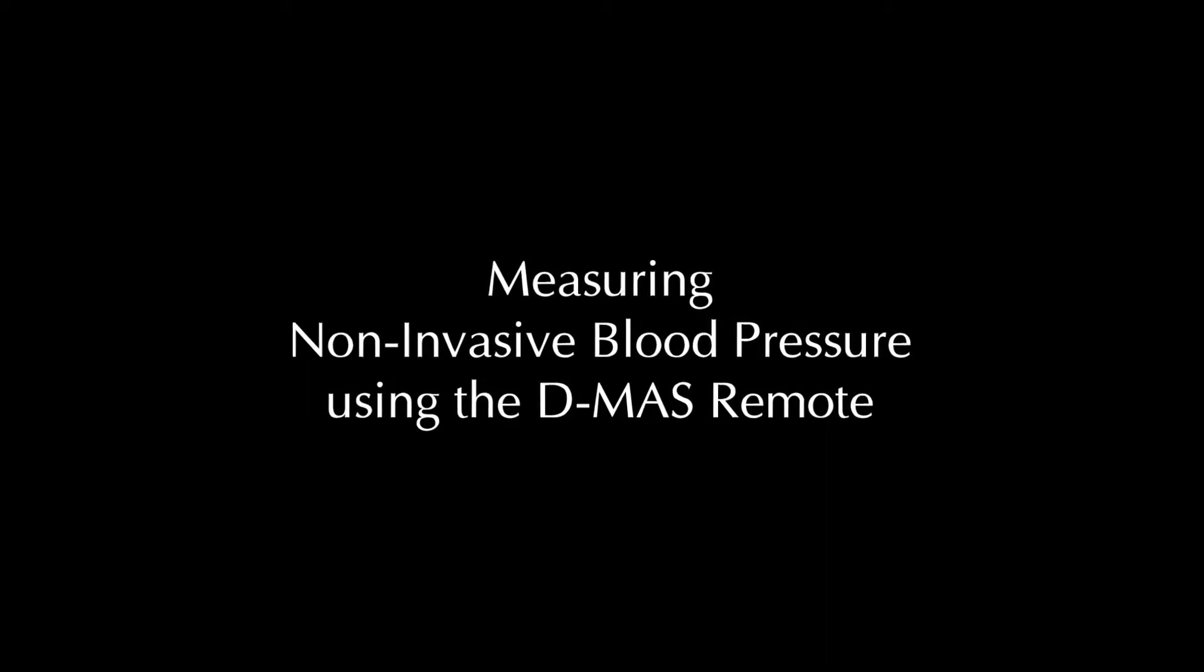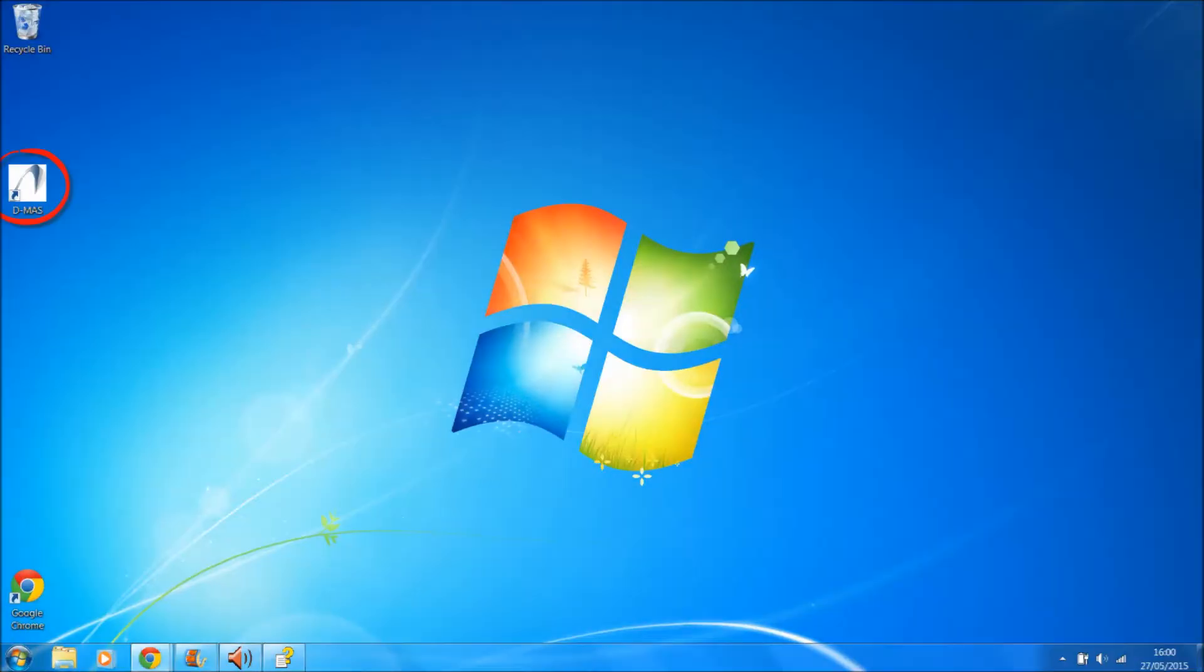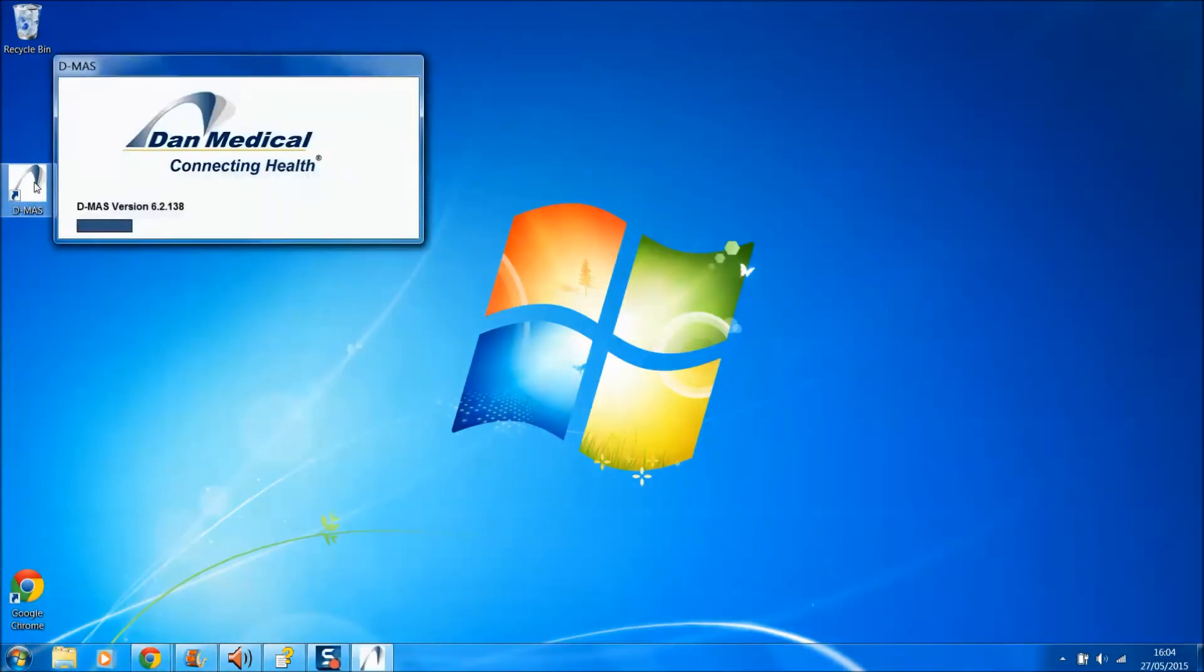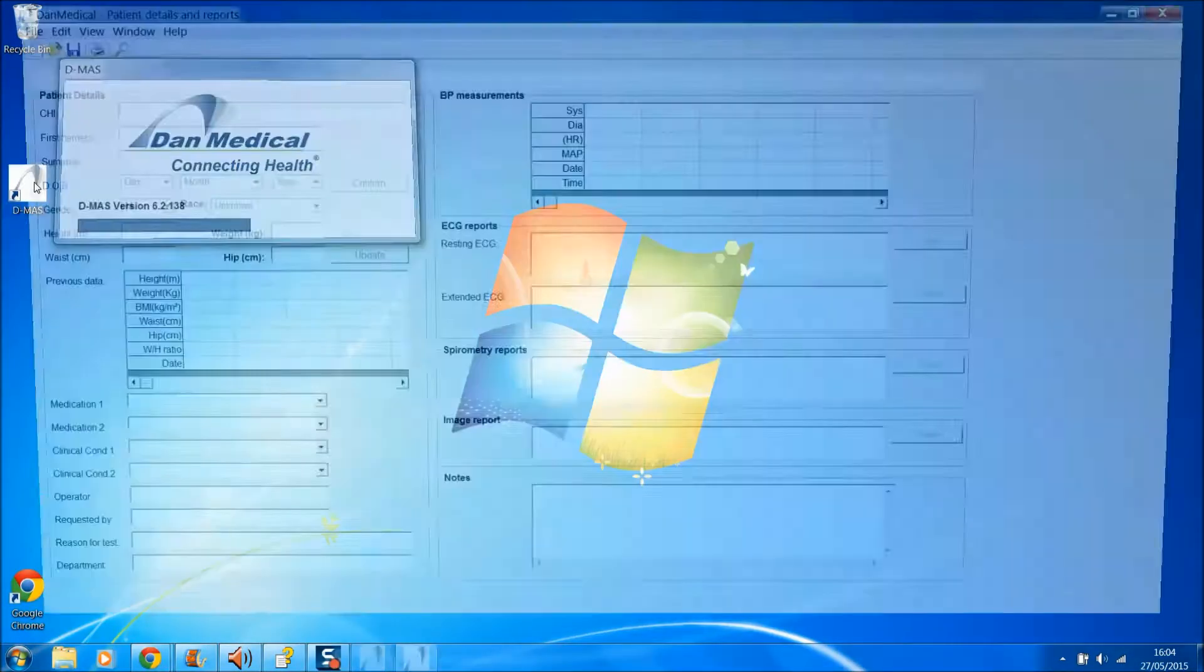This video shows measuring non-invasive blood pressure using the DMAS Remote. On the home screen, click on the DMAS logo to run the DMAS software.